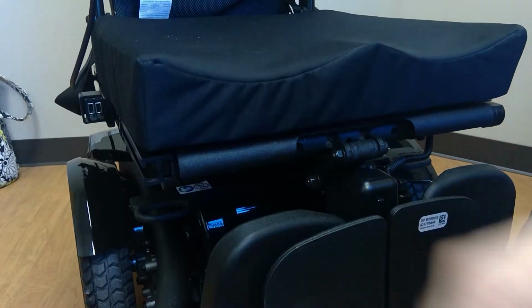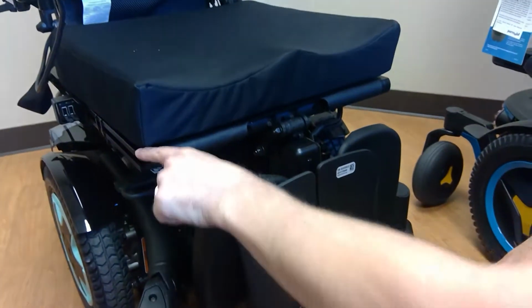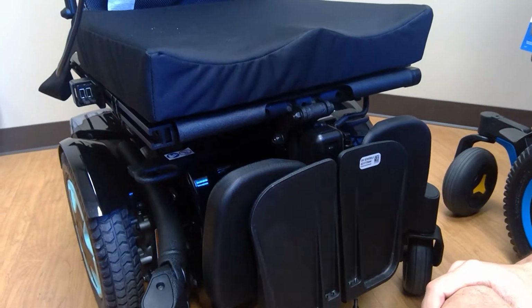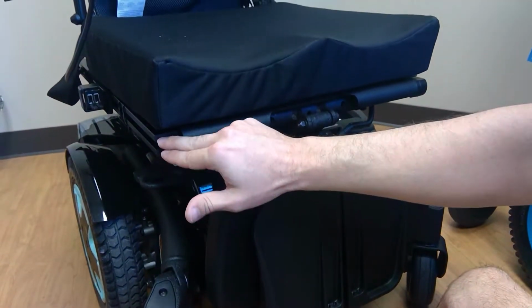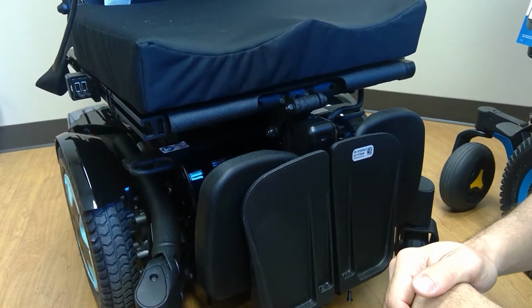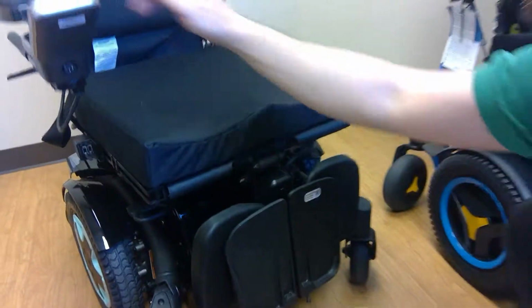What you want to verify is there are a couple companies out there, they're pretty infrequent now, that use a dovetail. So it doesn't look like this. It looks like a dovetail joint you would have in some old cabinetry. So when we're looking at this, we want to verify from the end that we're using that square cut channel or a T channel. And then we can order the proper channel nut fastener from our office.